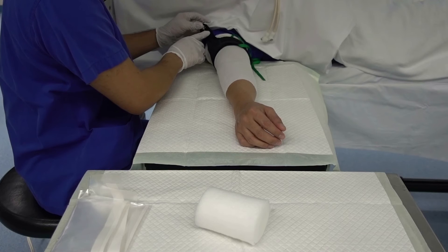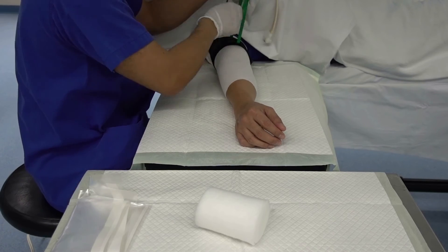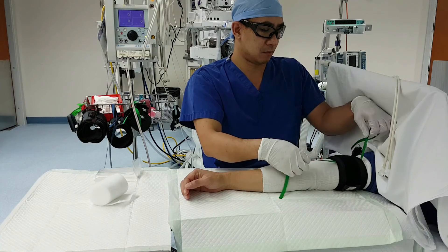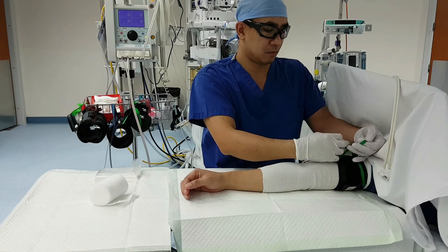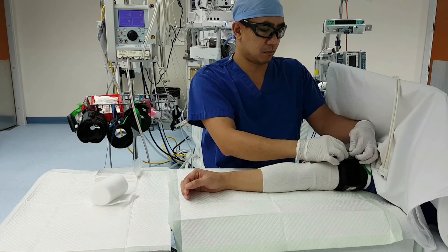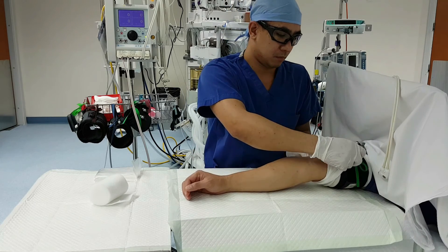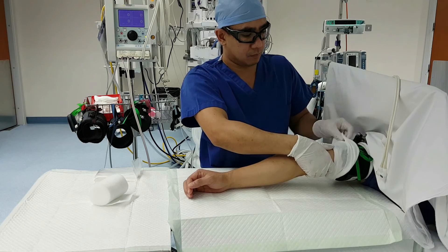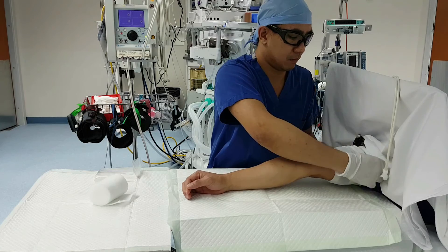The cuff tubing should be positioned on or near the lateral aspect of the extremity to prevent kinking of the tubing. Once you secure the laces, you can pull the remaining stockinette up and cover the bladder cuff. This will protect the skin of the patient from direct contact with the bladder cuff. You are now ready to connect the hose to the port of the bladder cuff.